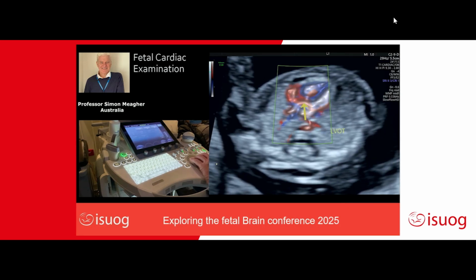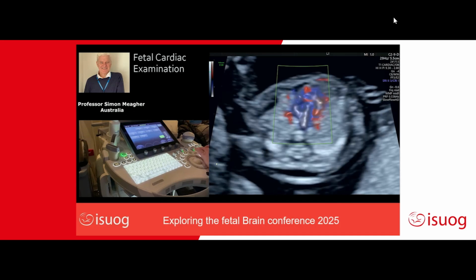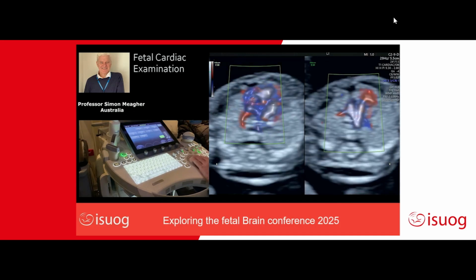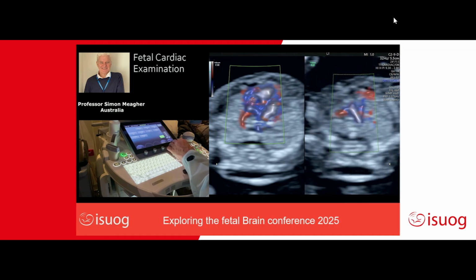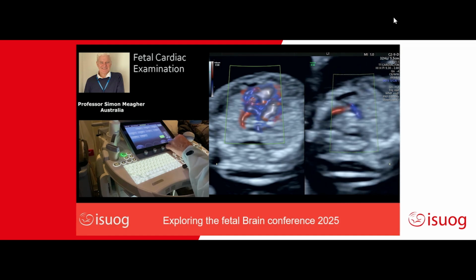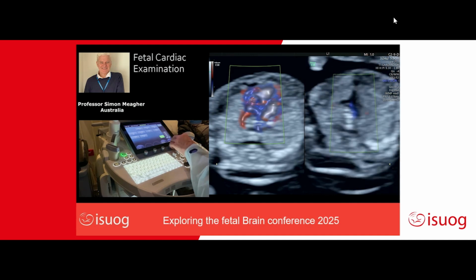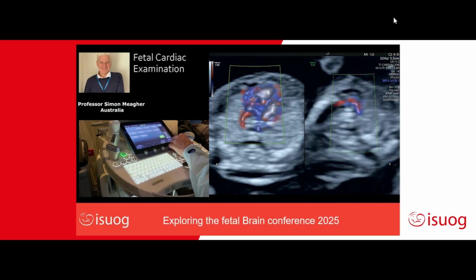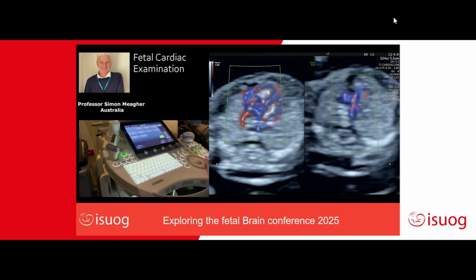You can see the swan neck-like curvature of the aorta. And then you can sweep up to your 3-vessel tracheal view. And you can do that as a split image. So if you show your 3-vessel tracheal view, again, controls are gain. And more so in slow flow, you need to control your power. So I'm down to 78 for power. And then you can demonstrate your 3-vessel tracheal view.